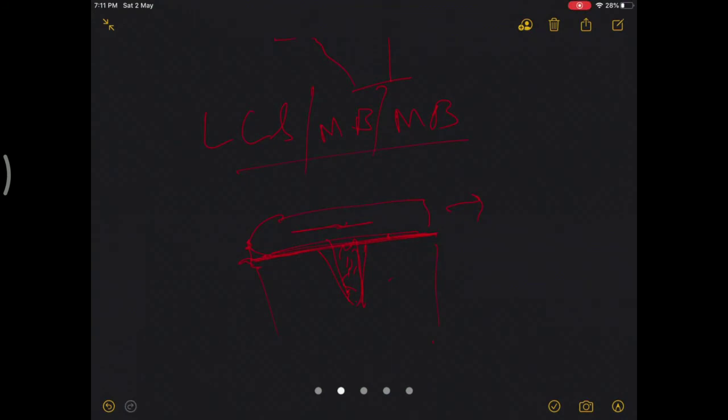So yeah, these are the advantages of this meniscal bearing, but they still come under some C or D FDA, third or fourth FDA grade. That means they don't have proven advantages or risk assessment, but they seem to have some amount of advantages. So they can be used in selected cases after approval by FDAs.